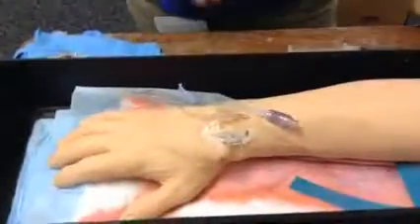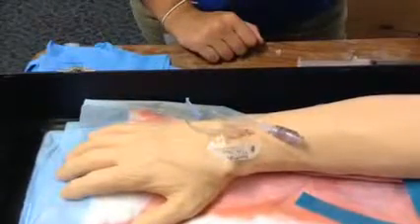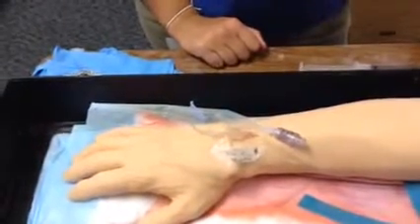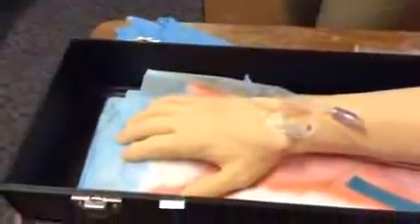Alright. Now, we're going to go ahead and draw up 6 milliliters of normal saline in the 10 milliliter device using the aseptic technique. And now we're going to reassess for any allergies. So, Mr. Smith, do you have any allergies that I should know of? Any allergies to cephalosporin or to penicillins? No. Gloves, latex, anything? Mm-mm. Alright. We're going to go ahead and wash our hands again, and then apply clean gloves.